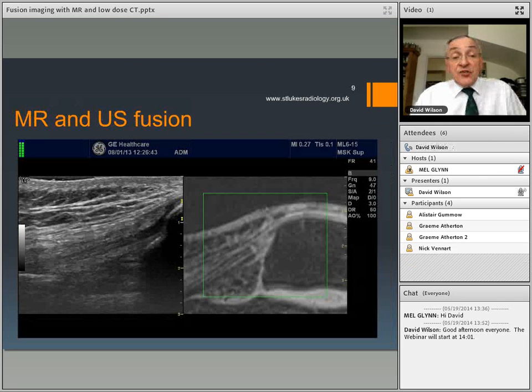If we look at another example here, this little sesamoid bone is actually the pisiform of the wrist. We're looking on an MR, very zoomed down, and we're looking on the ultrasound, and we can see here the muscle, subcutaneous fat. We can see exactly the same structures on the MR, because the MR shows us the joint surface underneath and the articular surfaces.